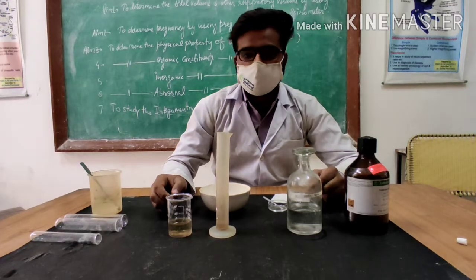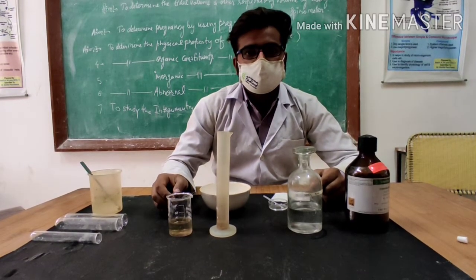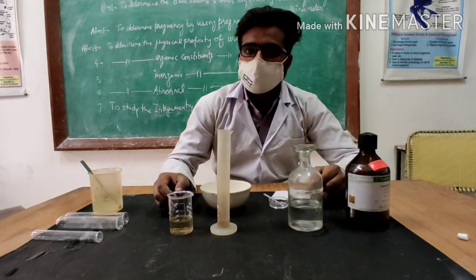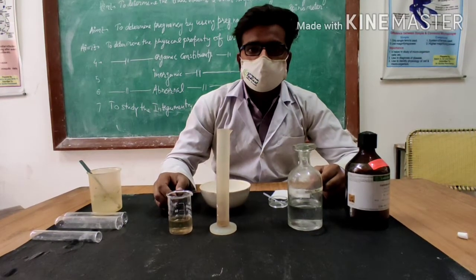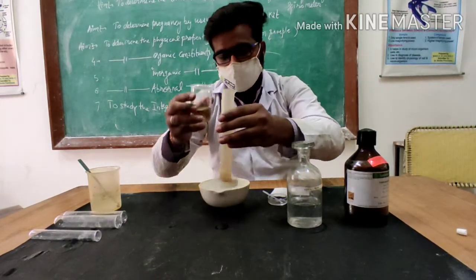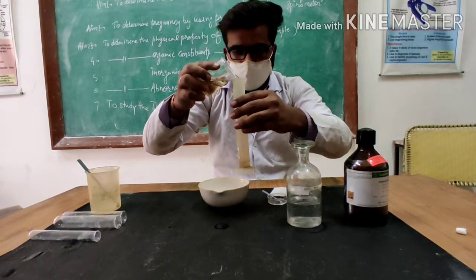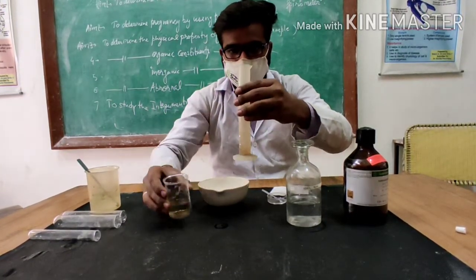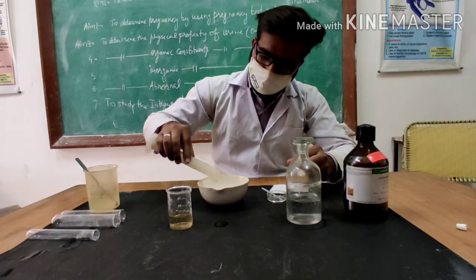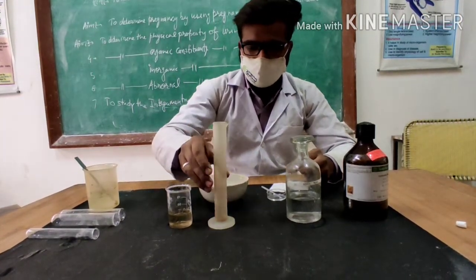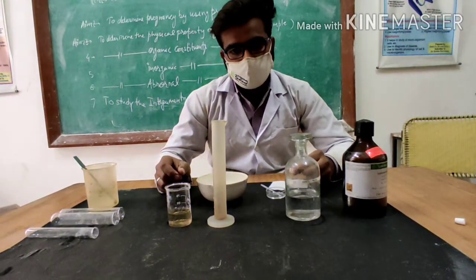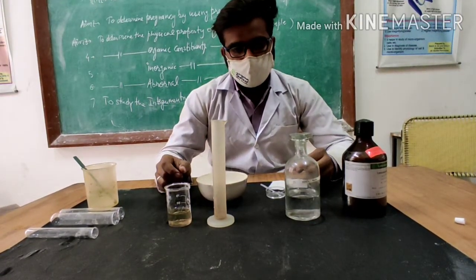The first test is for the determination of uric acid in the given urine sample. In this experiment, firstly we will add 5 ml of urine in a porcelain dish. After that, we will add 2 drops of concentrated HNO3.